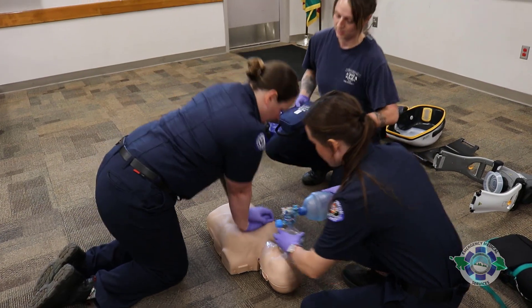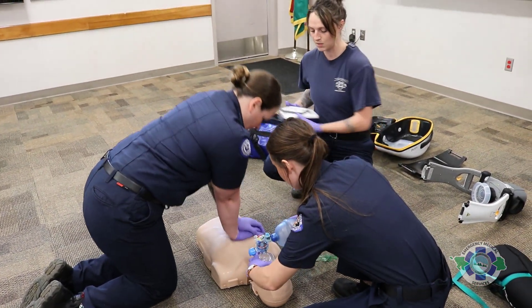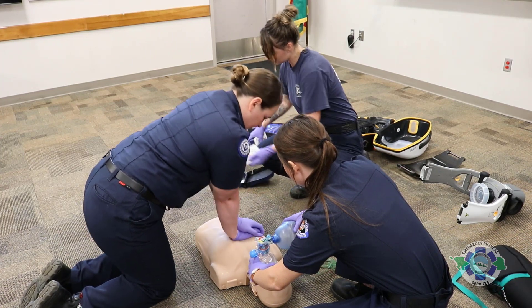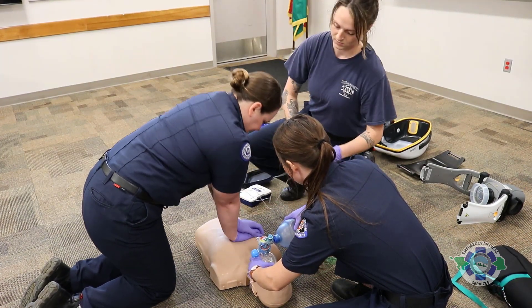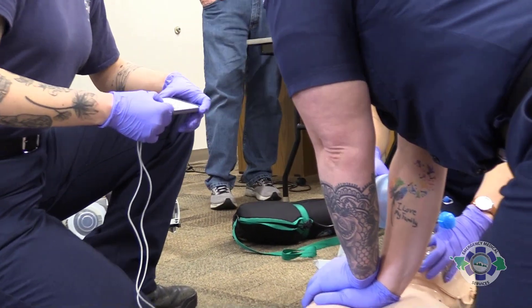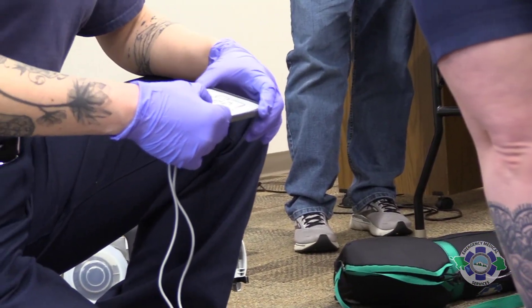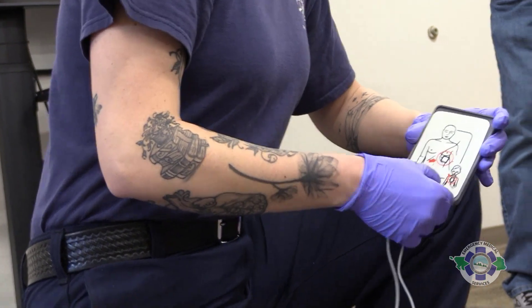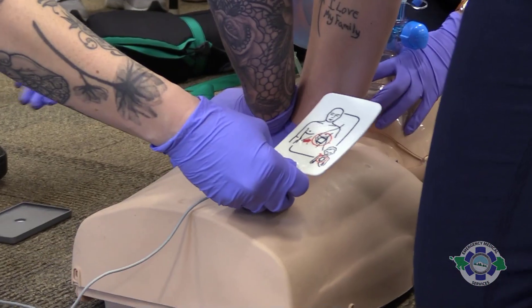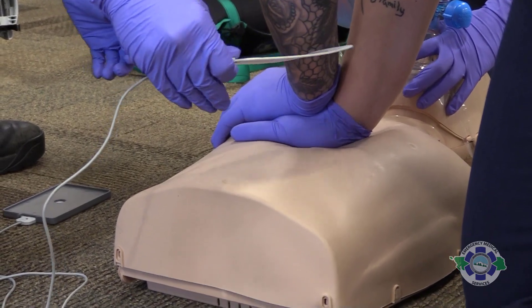We're going to start high-performance CPR per protocol, just like normal. We will place the AED pads as soon as possible, but we do want to make sure that we are waiting to place the Lucas device until after at least one round of compressions — one two-minute round of compressions.